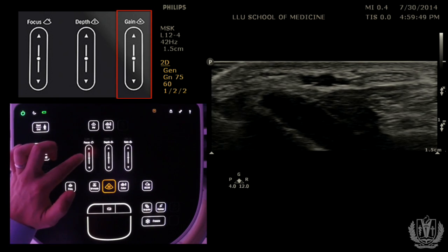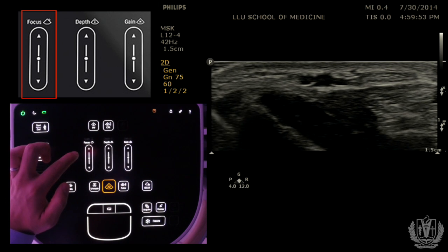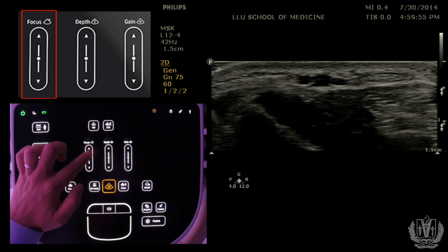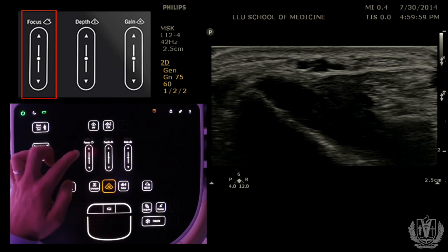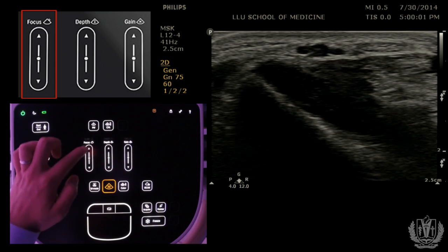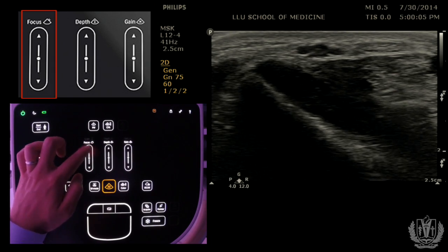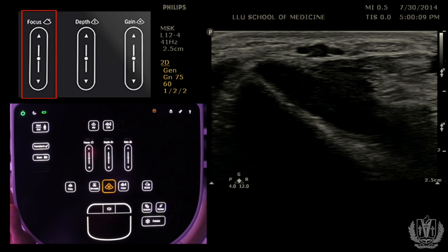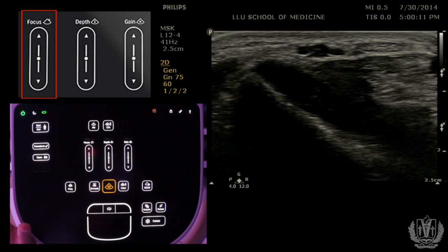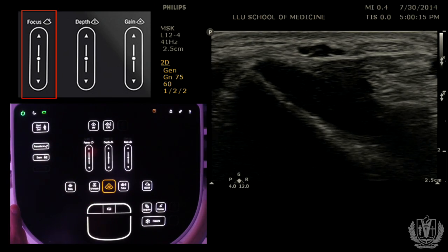Another button that some machines have is the focus button, located to the left. On the right side of the screen you'll see a couple of arrows, and when you adjust the focus button those arrows move up and down. When you're scanning in any mode — like cardiac mode — you want to make sure that the focus is on the area of interest, because that will increase your resolution at that focal point.